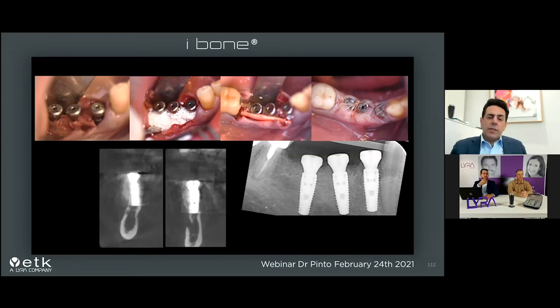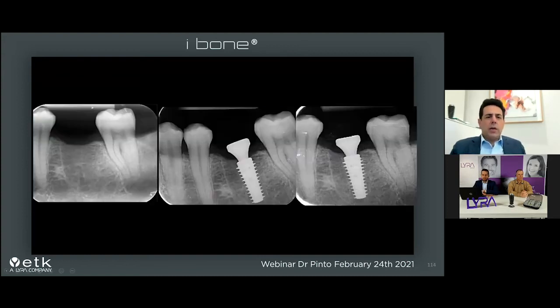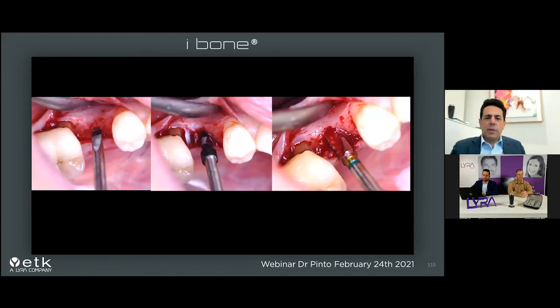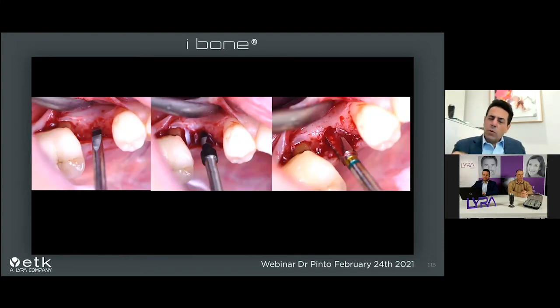And we can do exactly the same for this patient. You see the bone is a little bit thin, and we would like to put the implant in and try to do exactly the same procedure as before. So we show you the X-ray after the surgery, and I show you what we did, exactly the same as before. We use the pilot drill, and after we go back with the reamer, like that, we condense all that we can of the bone, okay?